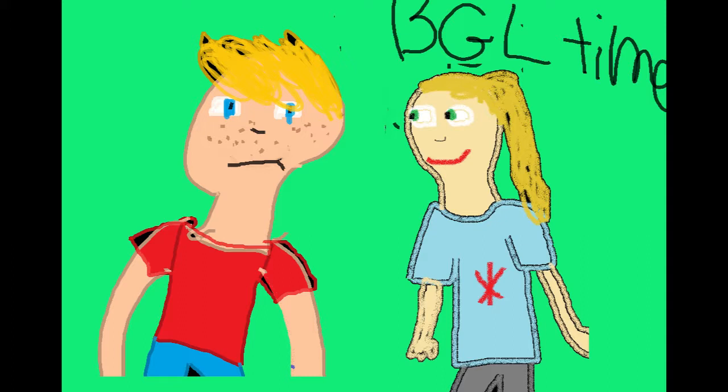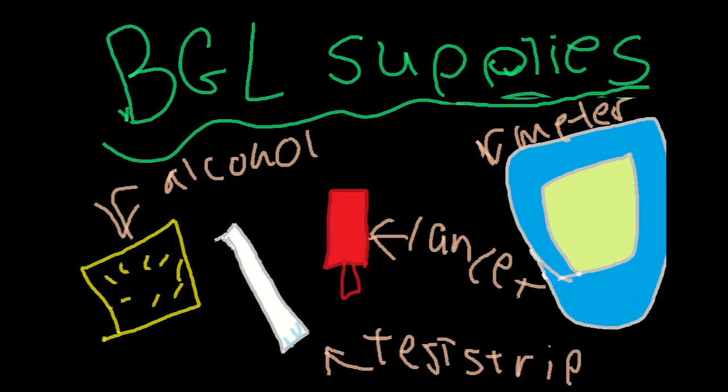Jack, I'm going to take a blood glucose test. You will feel a pinch, okay? Just a reminder, always tell your patients what you're doing. Even if the patient is altered or completely unresponsive, there is evidence that the patient still benefits from hearing your voice. To take a blood glucose reading, set up your supplies.